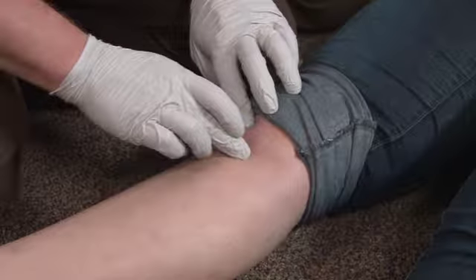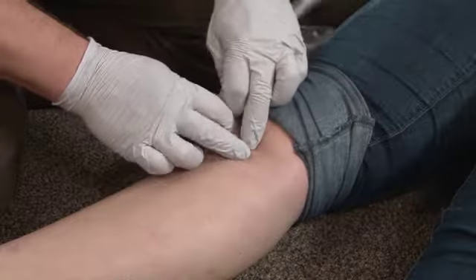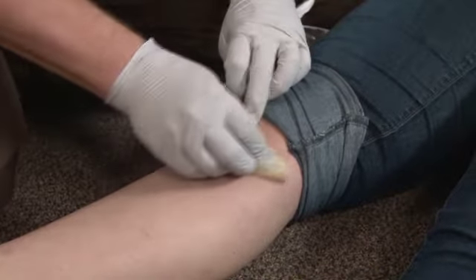To obtain intraosseous vascular access, the provider identifies the insertion site and the landmarks. If the tibia is the insertion site, the lower extremity is stabilized by another provider as necessary. The insertion site area is cleansed with an antiseptic.